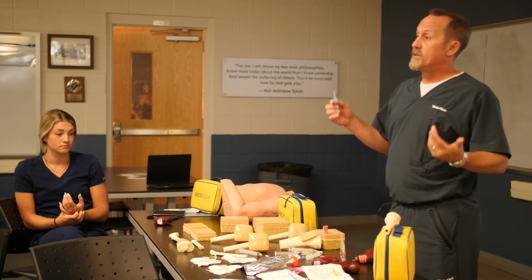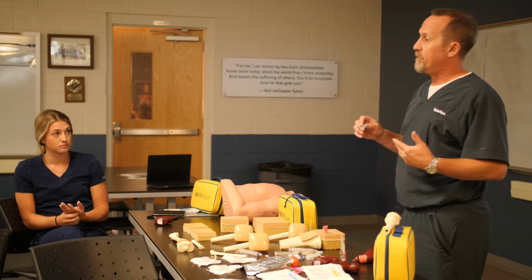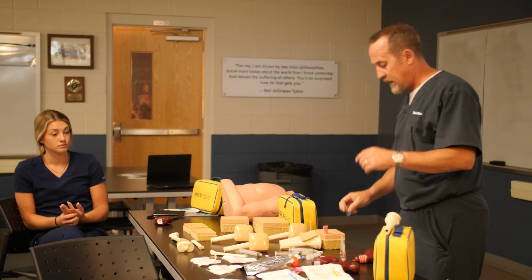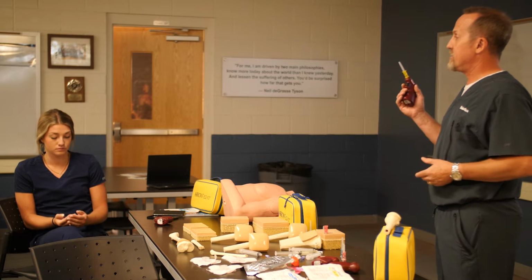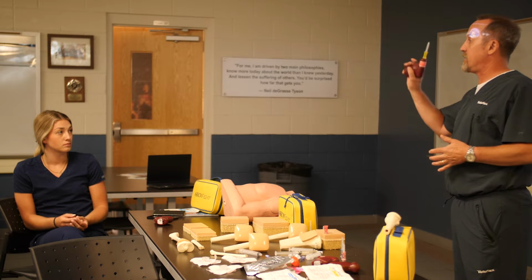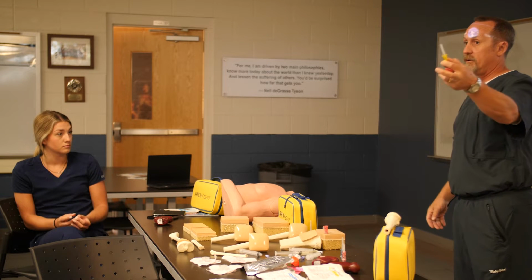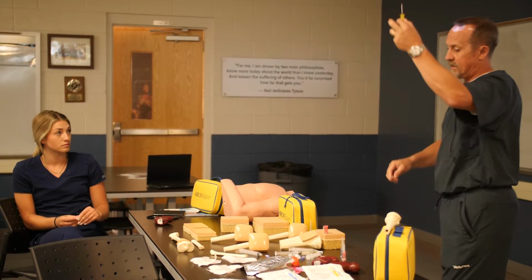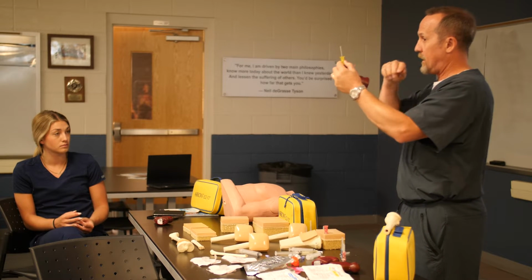And we'll talk about when we insert these too. It doesn't matter really if you're using a pink or blue on a pediatric patient, it's the placement. And I'll get into that in just a second. So, I'm just going to walk you guys through application of these. You're going to take your needle set, you put it on your driver. Make sure you cradle the gun and hold the actual hub. Slide the needle cap off. We're always going to make sure we see black lines here, okay?